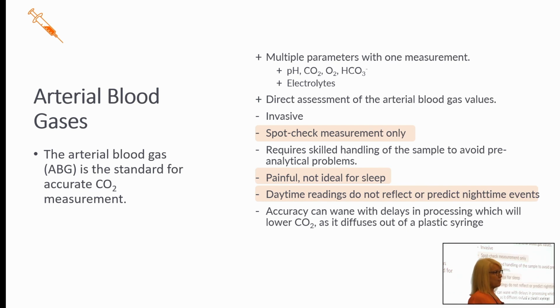It's also recommended not to use your daytime blood gas to find out what's going on at night with these patients. As I mentioned before, studies have shown that many patients who have overnight events have normal CO2 on their daytime blood gases.